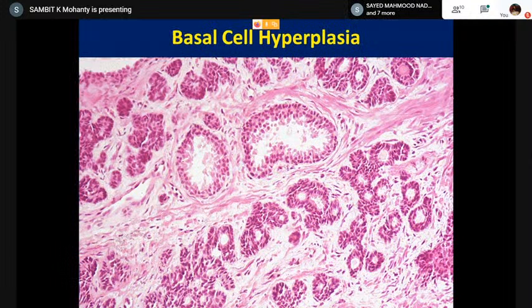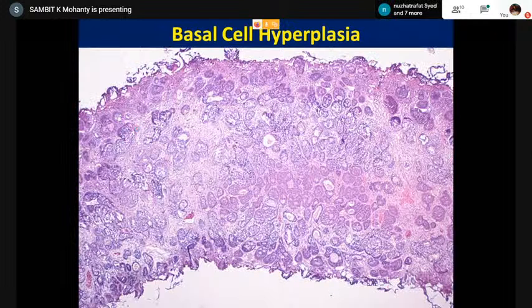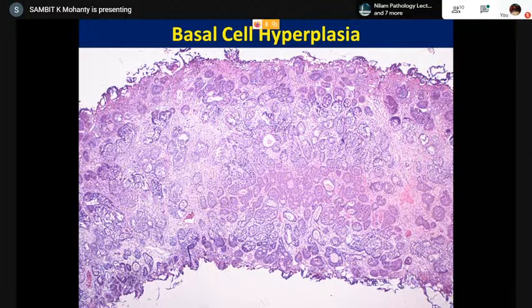So this is what, there's multi-layering, and you have this pink stuff, they can undergo calcification. And these are called vague or pseudo-cribriform. I'll show you, you can have a cord-like arrangement here. And the cribriform structures, what you see here is, you don't see a typical pattern 4 or cribriform PIN or intraductal carcinoma cribriform type. They are more irregular, rather a hyperplasia of basal cells which are filling up the lumen.